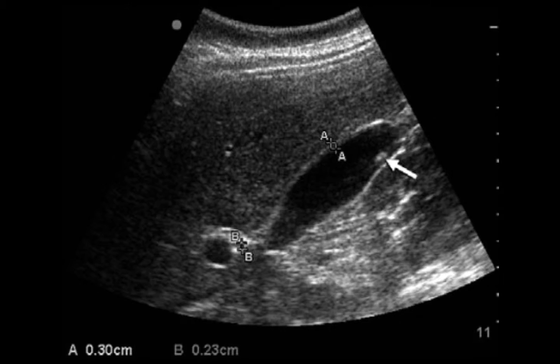A polyp, as seen in this slide, noted by the large white arrow, is a common fake out for a gallstone. Note that polyps should not create acoustic shadows, and they do not move as the patient moves. Changing position will cause gravity to act on gallstones, whereas polyps remain fixed in position. Although the lack of gallstones may be reassuring in a patient with acute abdominal pain, remember that polyps may represent malignancy and require follow-up, regardless of the acute clinical course.